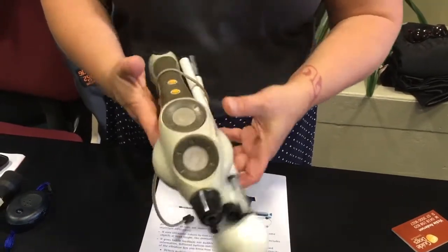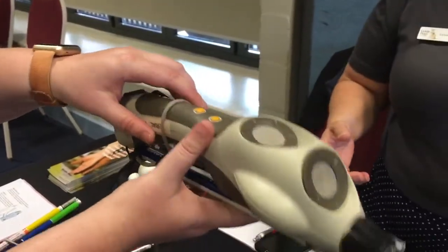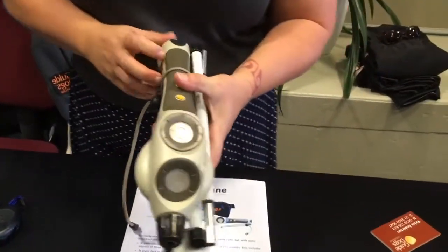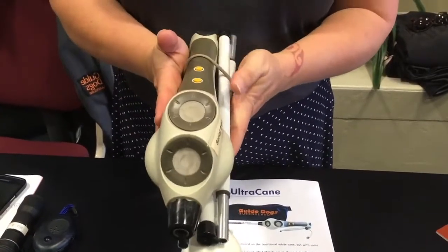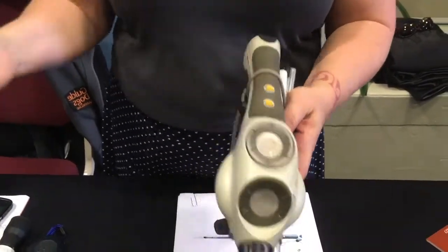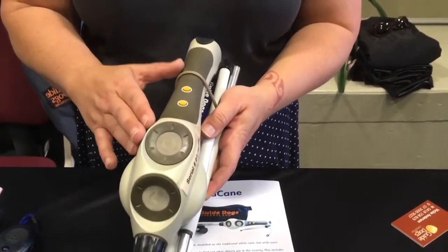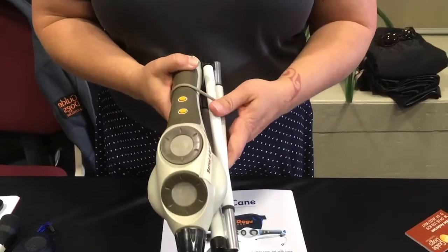One of the downfalls with this cane is it's quite heavy — you can feel the difference compared to a standard cane. Imagine the strain on your wrist getting used to it. Men tend to really like this cane, but women tend to give it back because of the weight. Someone with arthritis could not use this because of the weight and the way you have to hold it. So we're looking at alternatives — maybe keeping this one but also having a lighter, easier-to-use option that can suit everybody.